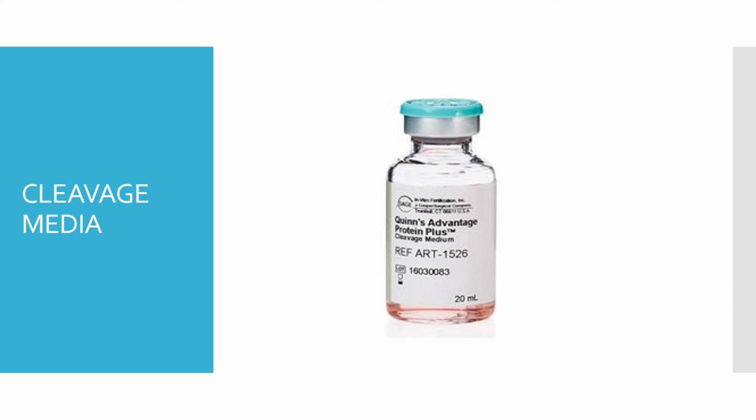Now, EDTA. What is EDTA? Ethylenediaminetetraacetic acid. EDTA's usefulness is based on its role as a ligand and chelating agent, that is, its ability to sequester metal ions. After being bound by EDTA, metal ions remain in solution but exhibit diminished reactivity. However, the presence of EDTA reduces blastocyst development and cell number. Gentamicin: embryo culture media are routinely supplemented with antibiotics to prevent bacterial contamination. Gentamicin prevents bacterial protein synthesis in the media.